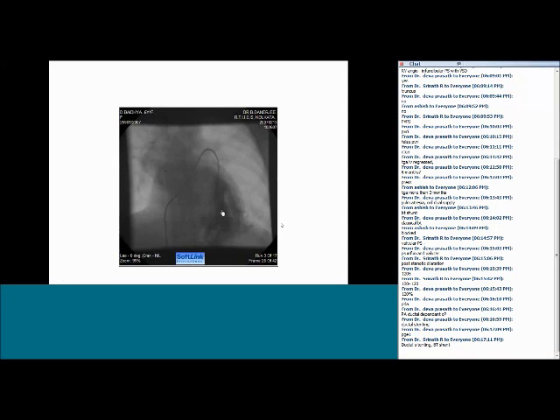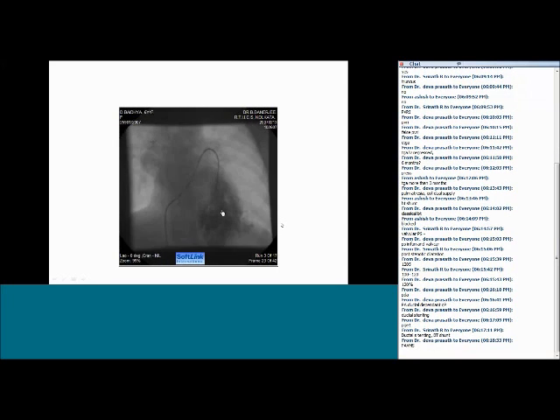This patient is cyanotic. Pulmonary AV fistula, absolutely correct. What are the treatment modalities in this patient? Pulmonary AV fistulas are usually multiple and might affect a lot of lobes in the lung. What are the treatment modalities in this patient?